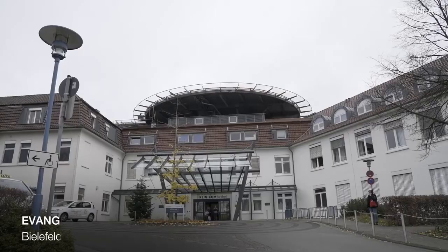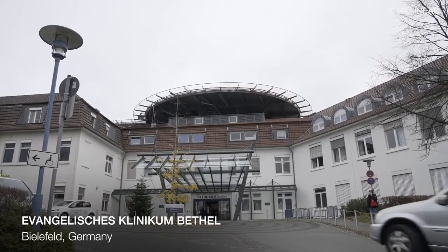I started using navigation already back in 2012 or 2013, while I was still working at the Department of Neurosurgery at the University of Bonn. Here in Bethel, we use it since 2016. The indications we treat using spinal navigation are from simple to complex instrumentation cases, from cervical to lumbar spine, including degenerative disease, trauma, tumor, and infections.